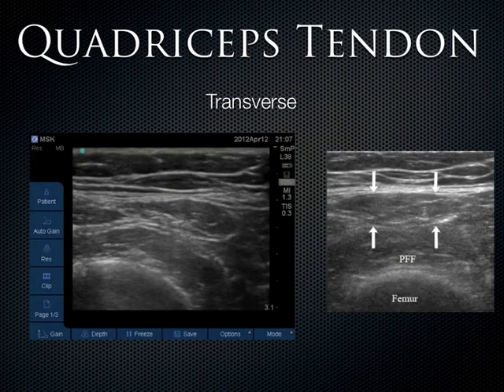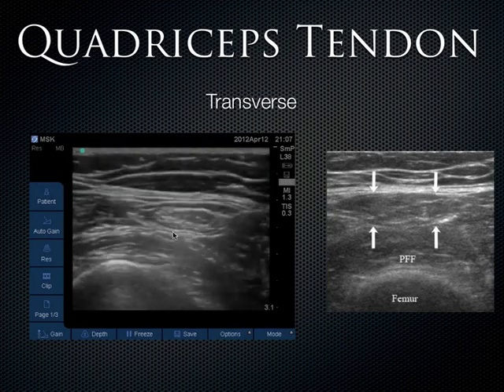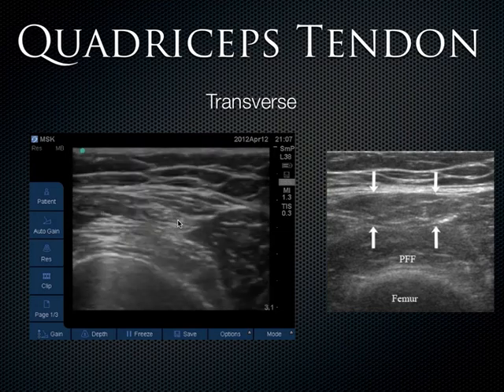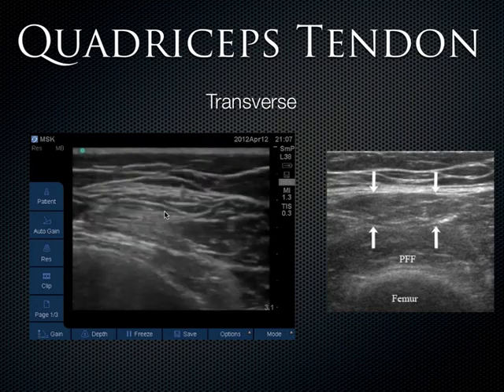Now we're in the transverse plane. Transverse, it gets a little bit harder to see. This is the femur here, seen as transverse plane, and this is that quadriceps tendon seen here. What we're doing is taking the probe more superiorly and then more distally, and that's basically what's happening in this video.